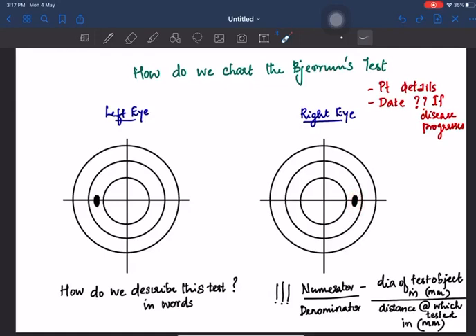So, your left eye is occluded, and while testing you will get a blind spot on the right side of your visual field, that is on the temporal side of your visual field. Similarly, for the left eye, you will get a blind spot on the left side of your visual field. So, by locating the blind spot, we can identify which visual field belongs to which eye.